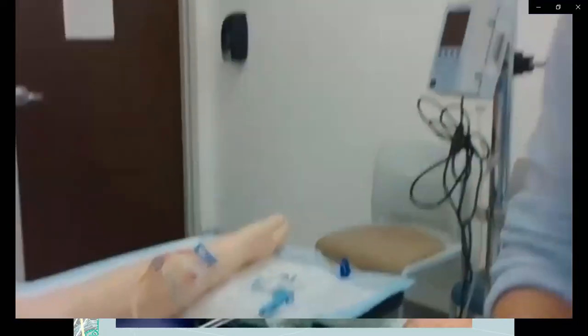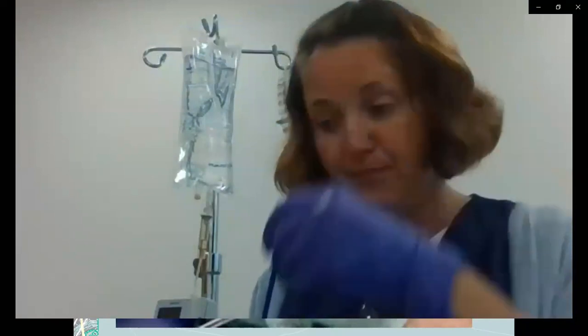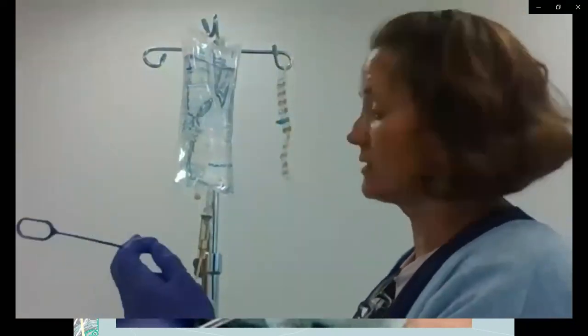Okay, so now let's look at if we're going to give a secondary medication through our primary line. All right, get your supplies together. Things we're going to need are your secondary medication, whatever it is, secondary IV tubing, and this little hangy thing. I'm sure it's got an actual name.